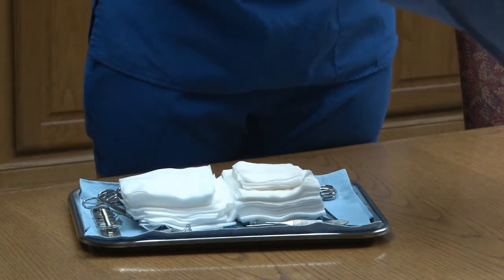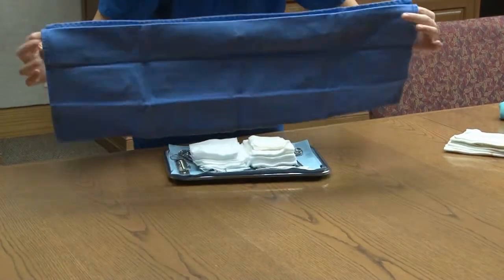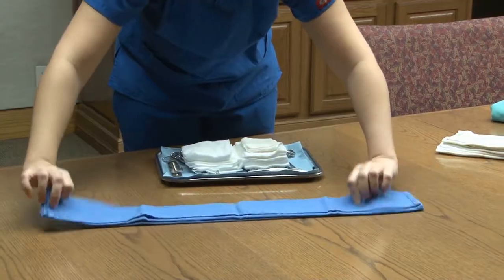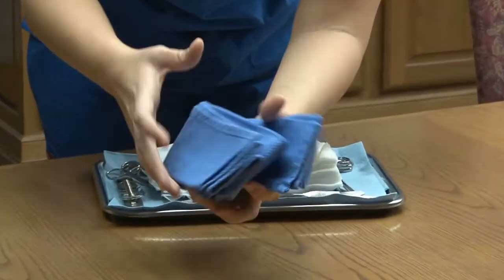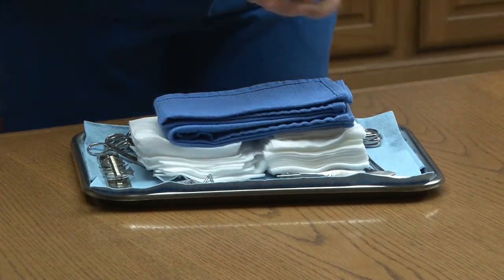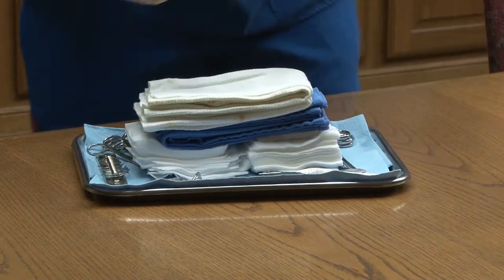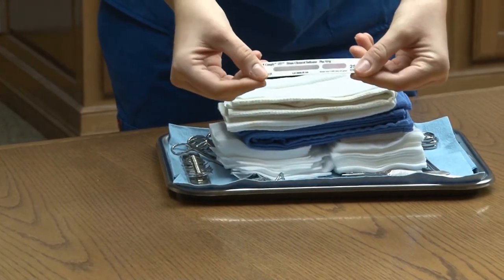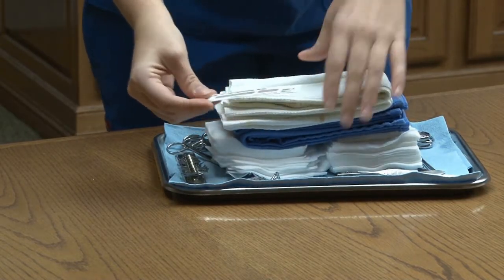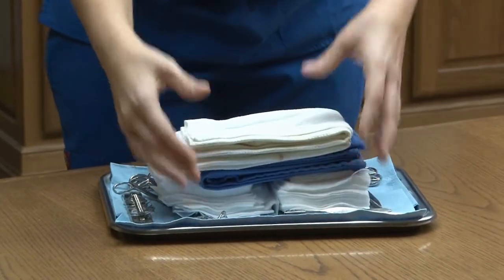With a drape towel, you want to accordion fold it — you take it and fold it over, just like an accordion, then fold it again to fit, and place that neatly. I have two more drapes to add in. And this is a really important step: you want to place an indicator strip anytime you are going to sterilize a surgery pack to make sure the inside of the pack really did reach the correct temperature. Bury it deep in the pack to ensure steam got through the whole pack.